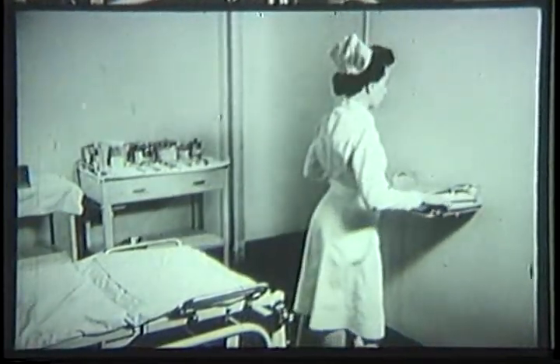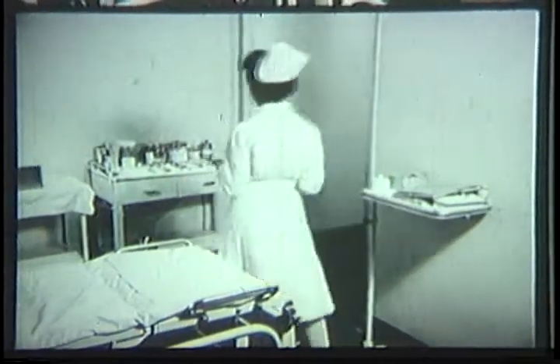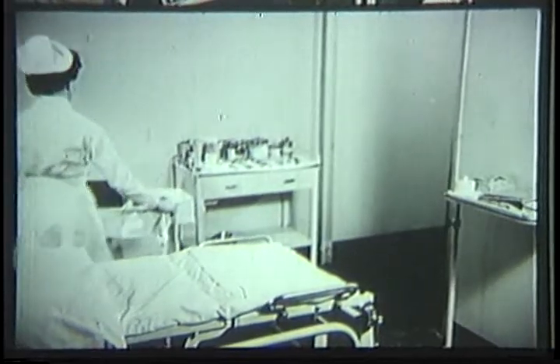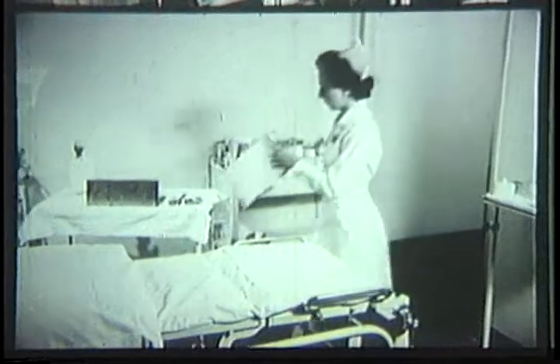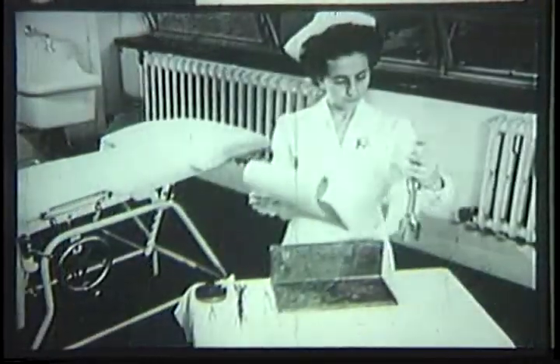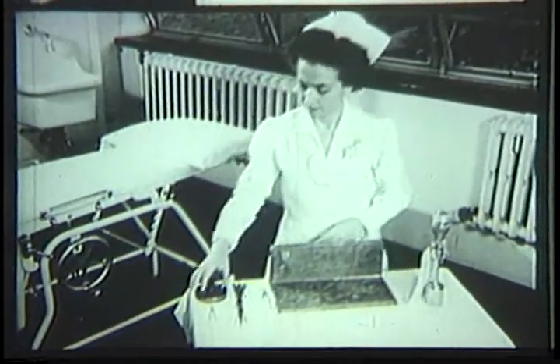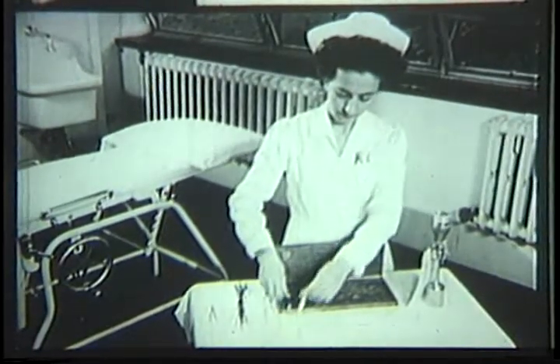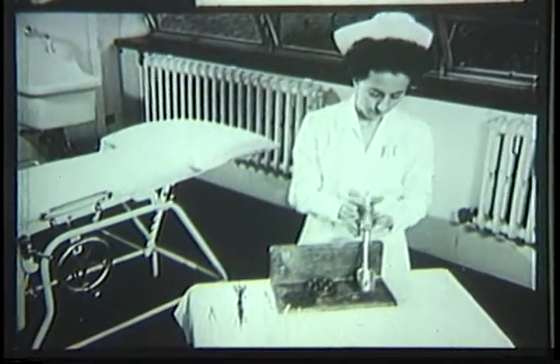The nurse who administers radon seeds should use great care in handling them. They're deceptively small and they look harmless enough, but their radiations are very powerful. They're delivered to the operating room in lead containers called applicators. The nurse selects from the applicator the correct number of seeds to make up the dosage prescribed by Mrs. Gordon's doctor.